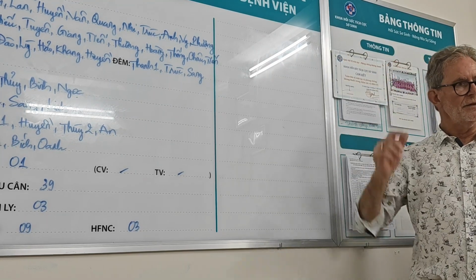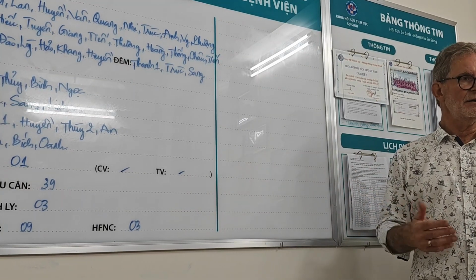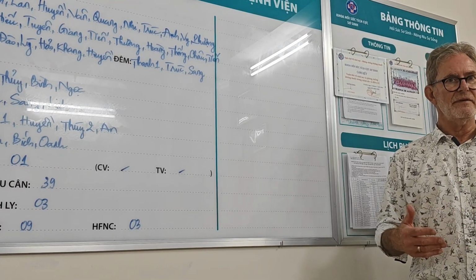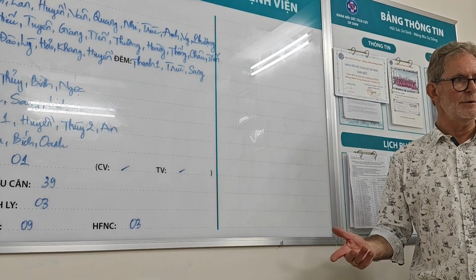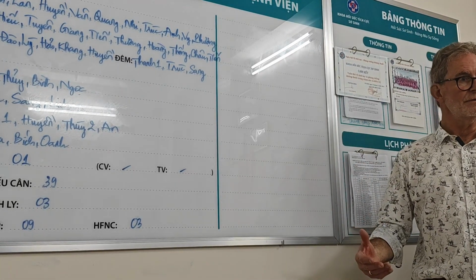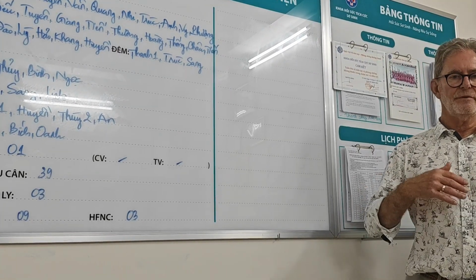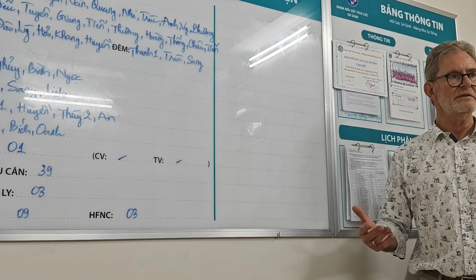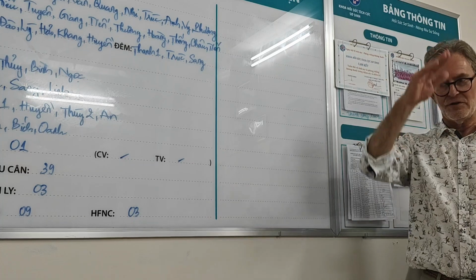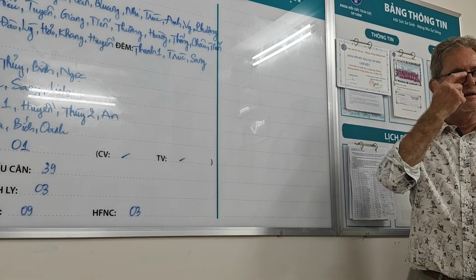Now we saw that in the 1990s when we didn't know this, and we didn't worry too much about low CO2s, and what we were seeing was babies surviving with periventricular leukomalacia, and it was found that that was related to low CO2s. So I'm always really careful when I swap from conventional ventilation to high frequency ventilation in monitoring the CO2 to make sure it's not going like that and ending up at 20 or 15 when I do my next blood gas.